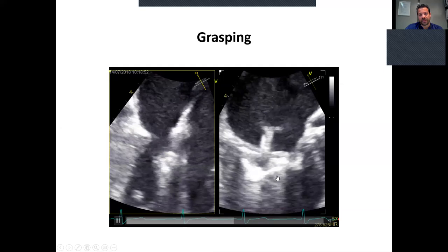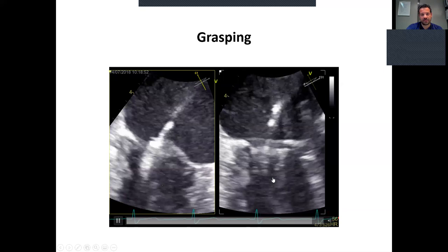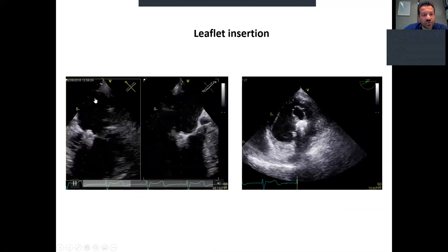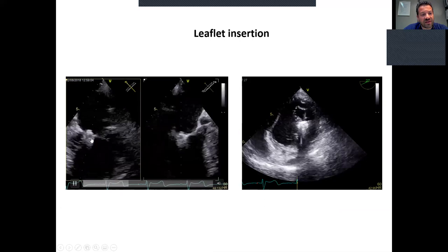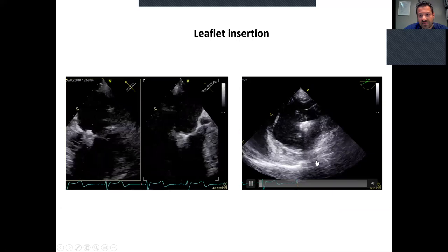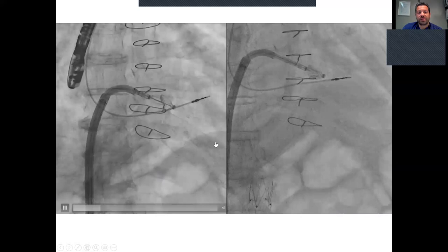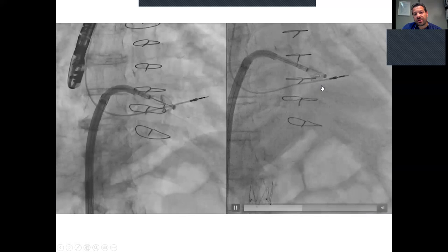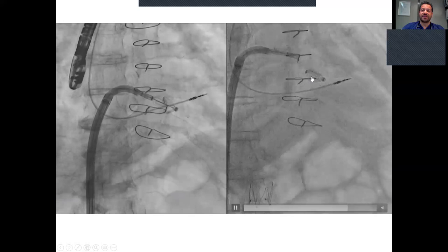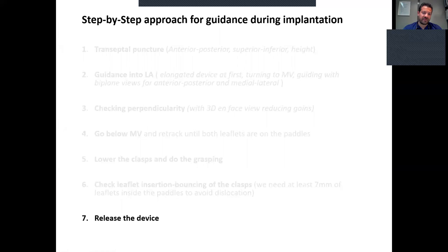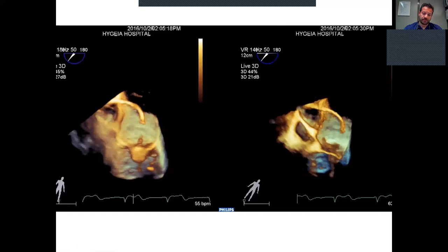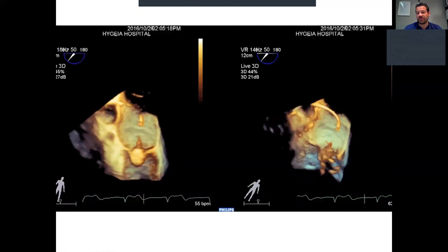If we see the bouncing of the clasps, we are sure we have a nice result. After grasping the anterior and posterior leaflets, we must perform the leaflet insertion assessment. We scan at the commissural view from the right and left sides of the paddles to check for nice grasping, and go to the transgastric view to confirm both leaflets are in the paddles. With fluoroscopic view, we can see the paddles open and then closed before device release. The device can be released after confirming enough leaflet tissue in the paddles, demonstrated with both fluoroscopic and 2D/3D views.